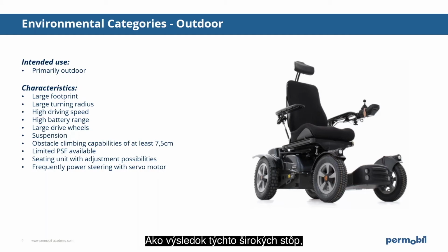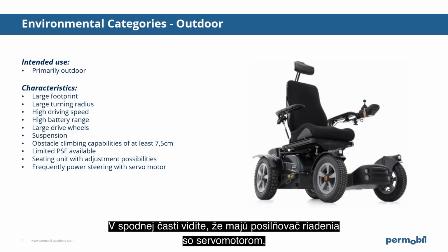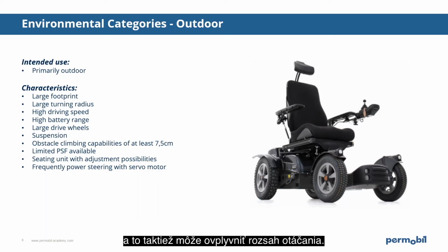As a result of this large footprint, these devices have mostly a large turning radius. And at the bottom, you see that I have mentioned that they frequently have a power steering with a servo motor, and that can also cause the turning radius to become quite large.